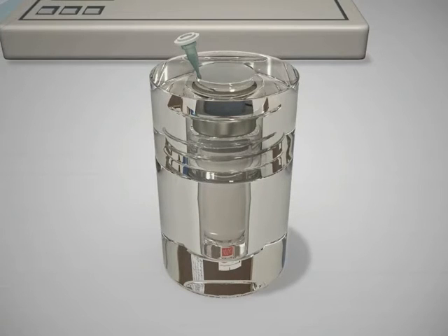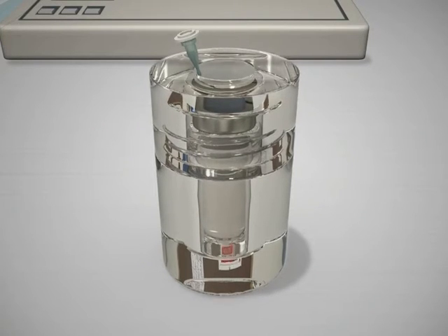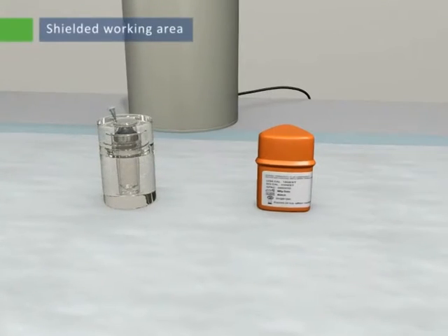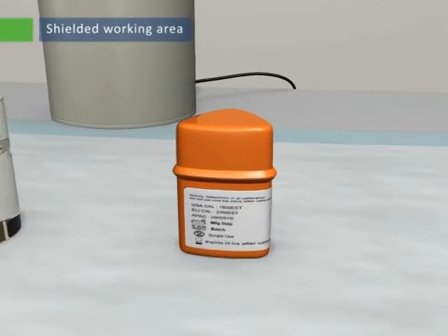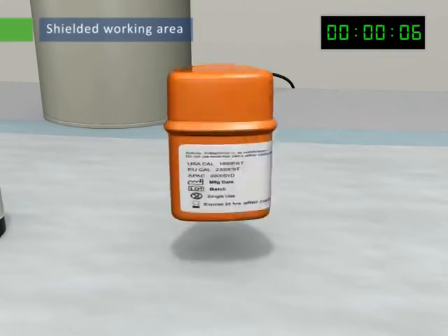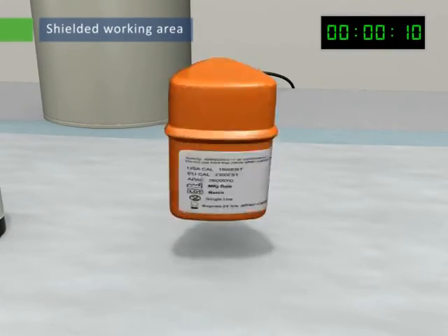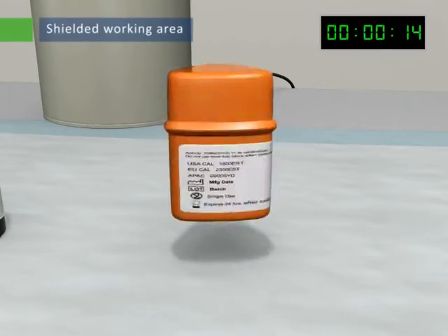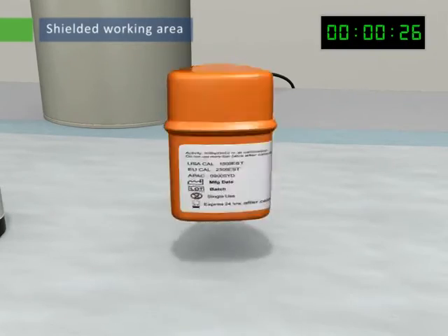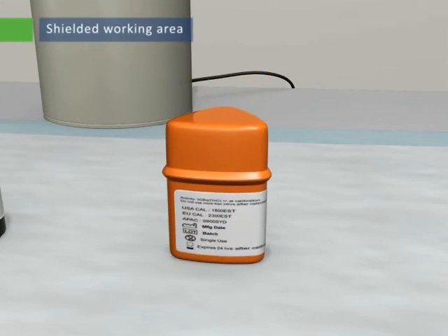The V-vial is now ready to receive SIRSpheres microspheres. Place the V-vial holder near the lead pot containing the microspheres in the shielded working area. Invert the lead pot several times before opening to re-suspend the microspheres, which will have settled during shipping. Adequate re-suspension can usually be achieved with thorough shaking if the lead pot is inverted and shaken for at least 30 seconds.